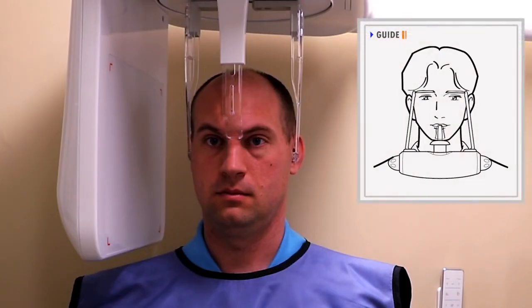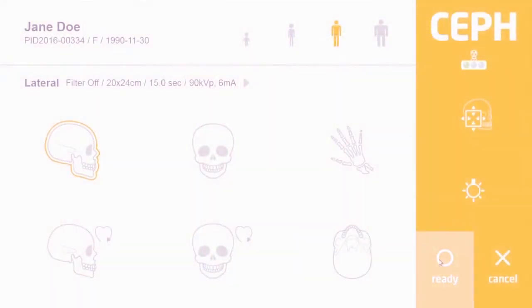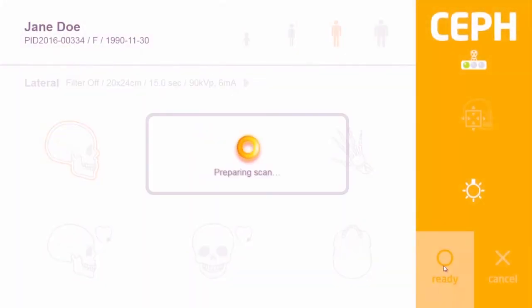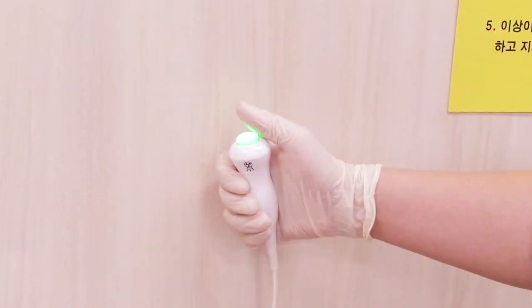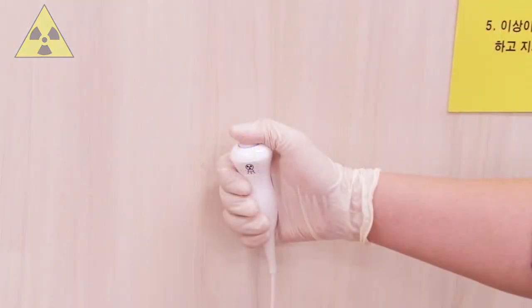When everything is ready, instruct the patient to close their eyes. Press ready on the remote control, touch screen, or scanner program. Press and hold the exposure switch as instructed in the scanner program for the entire exposure time, then release the exposure switch.